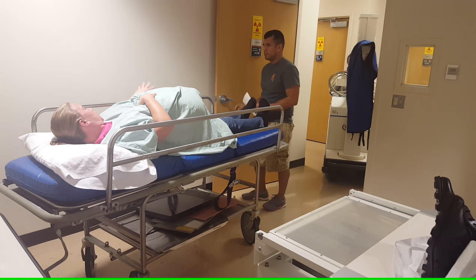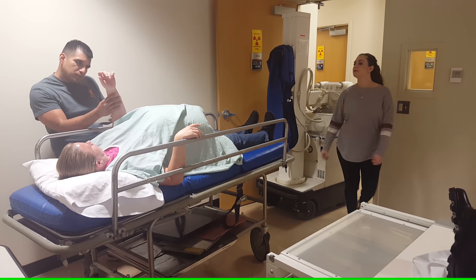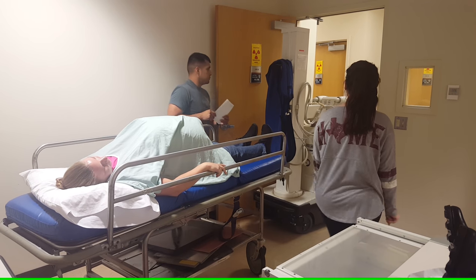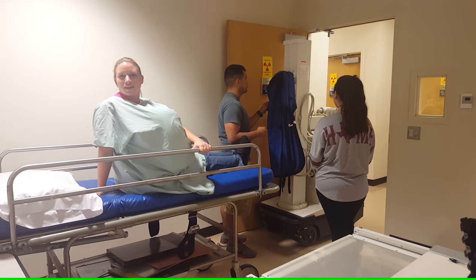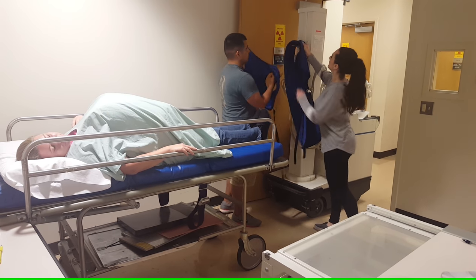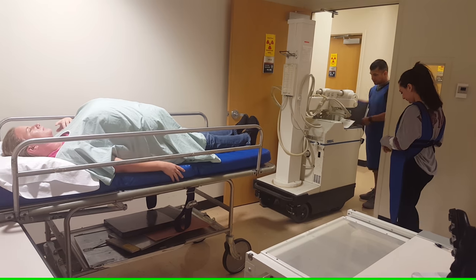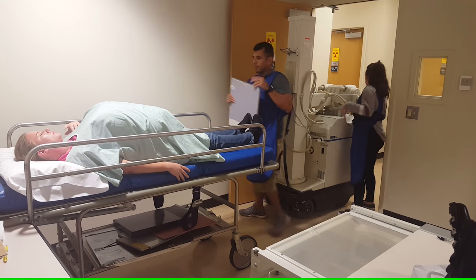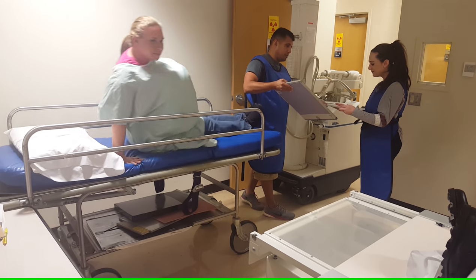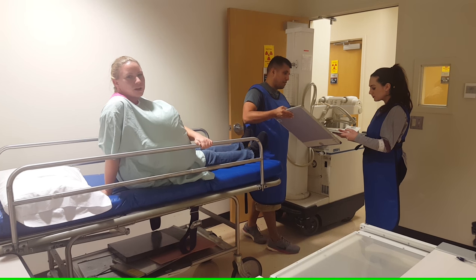Hello, x-ray. My name is Eddie, this is Andrea. We're going to be doing your x-ray today. Can I see your wristband? Mrs. Trump, can I get your date of birth? Lead aprons are made of 0.5 millimeters of lead to protect the technologist from scattered radiation. Don't forget your grid. Radiographic grids are made with radiolucent and radiopaque material that absorbs the scattered radiation — it only allows radiation traveling in a straight line to pass through.